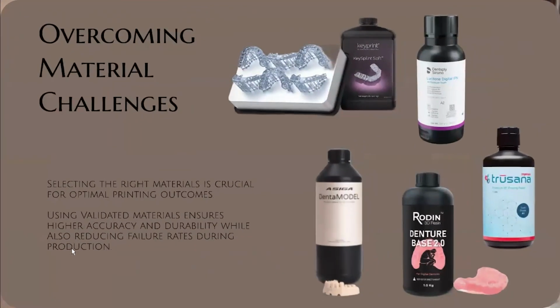So let's look at some of the solutions. Well, the good news is on the materials, there's not a big wall here. It's pretty darn easy, and you just have to dial that in. And I'm showing you some of the best resins here. I've been blessed to be in over 300 or 400 labs in the last few years, training and helping, and I can tell you that the ones you're looking at here are the ones I see everywhere.